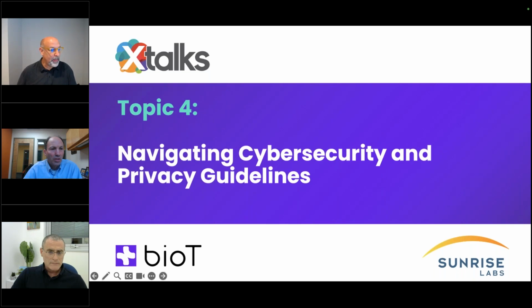So I guess, John, yeah, go ahead. Yeah, John, there's something I want to add. Daniel brought up a topic before of different levels of connectivity, of making the cloud part of your actual medical device. It's been a typical thing that we've been doing, is we will often separate. Let me back up. What the FDA regulates is the safety and efficacy of a medical device, and the whole framework is under the risk reduction part of it.